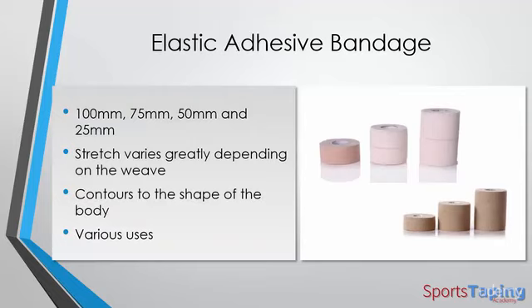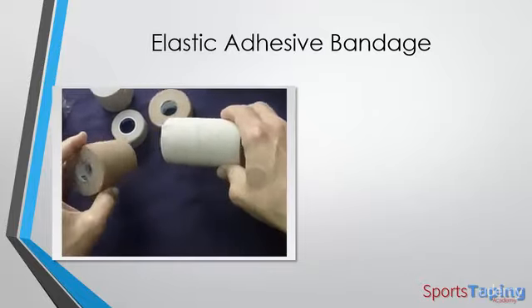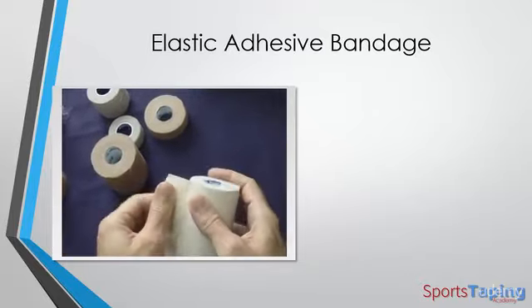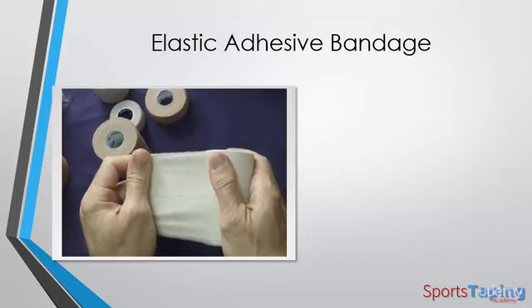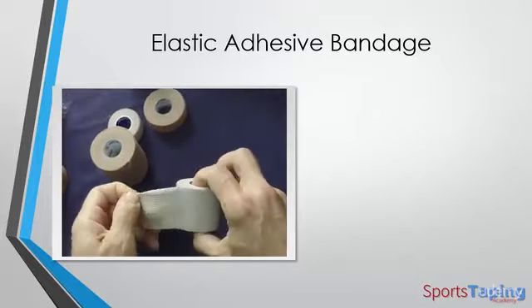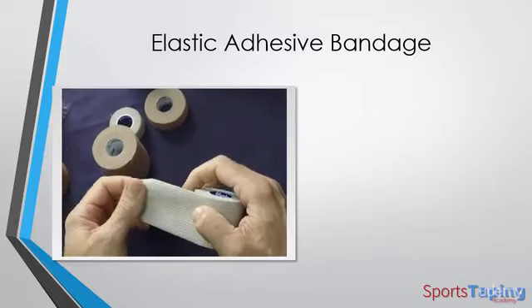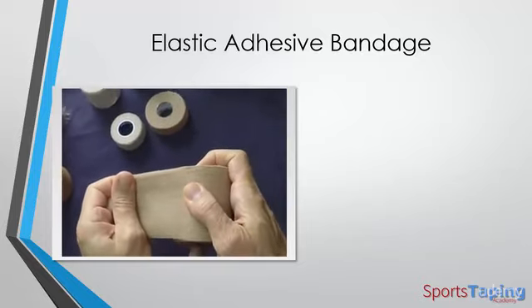Okay, so moving on to elastic adhesive bandage, otherwise known as EAB, or stretch bandage. And this comes in various sizes from 100mm, 75mm, 50mm and 25mm. Now the amount of stretch and quality will vary greatly from brand to brand and even type to type. So this particular weave has quite a lot of stretch. This weave here even has more stretch. This is very, very stretchy, this particular weave. Whereas this weave here doesn't give a lot of stretch at all.